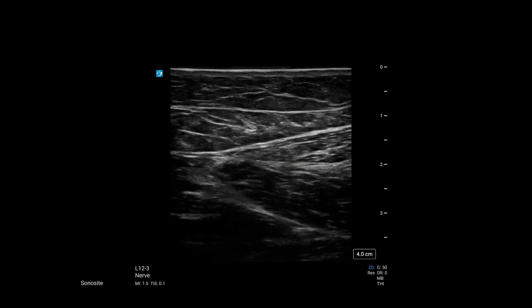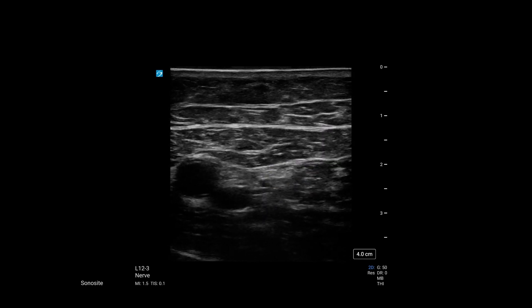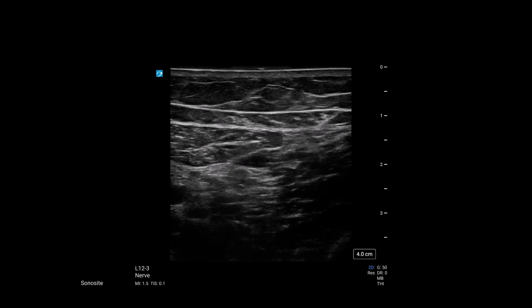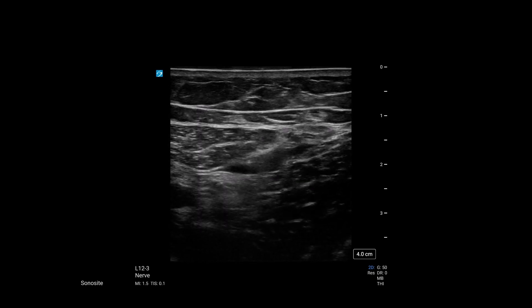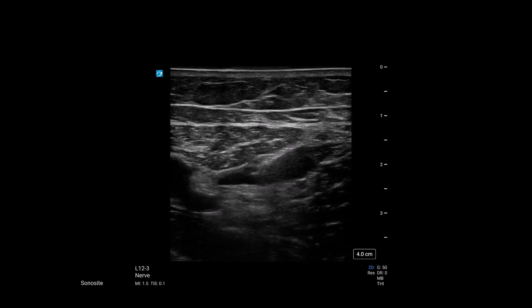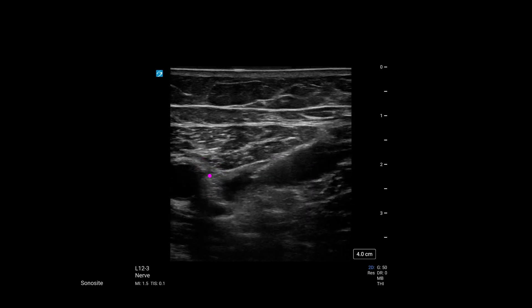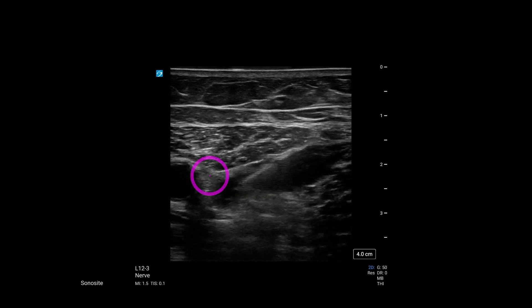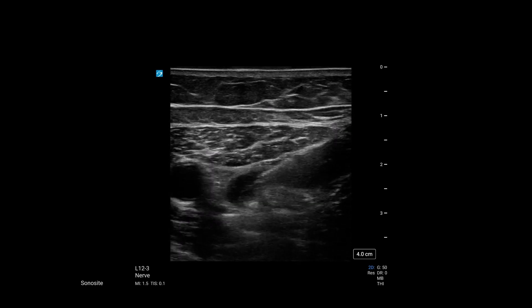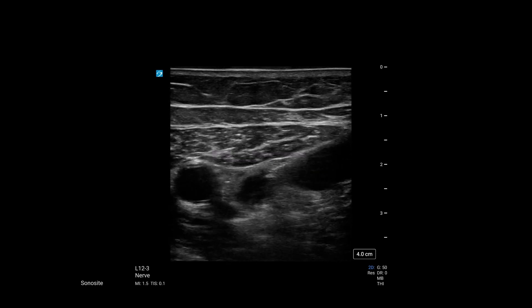Scan up and down, see them coming together — there we go, apex of the femoral triangle. Coming across, nerve to vastus medialis here, saphenous in there somewhere, and a vein right in our way. So what I've decided to do here is open up a plane between sartorius and the vastus medialis, and you can see that's opening up nicely. The needle's going to come through, nerve to vastus medialis here, and you get the sense there's no local going to where the saphenous is — no spread there. So we've got a decent amount of local there for nerve to vastus.